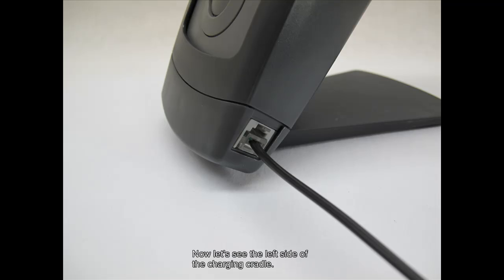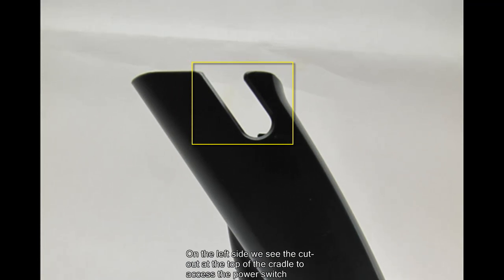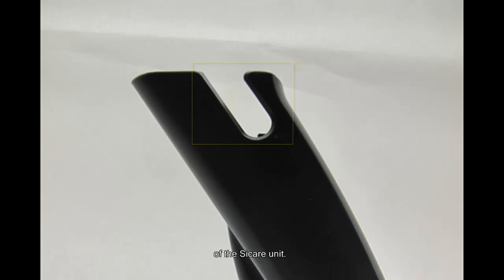Now let's see the left side of the charging cradle. On the left side we see the cutout at the top of the cradle to access the power switch of the Sicare unit. Remember that the Sicare unit will remain on and listening for commands when the unit is in the cradle and it is plugged into a wall socket, even when the Sicare power switch is in the off position. Now let's move to the top of the cradle.